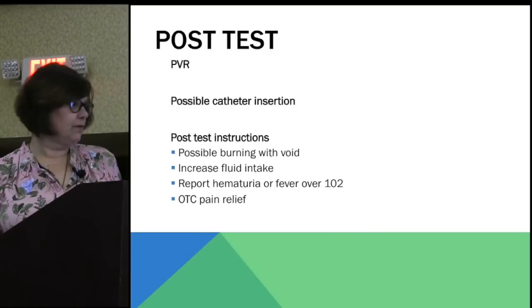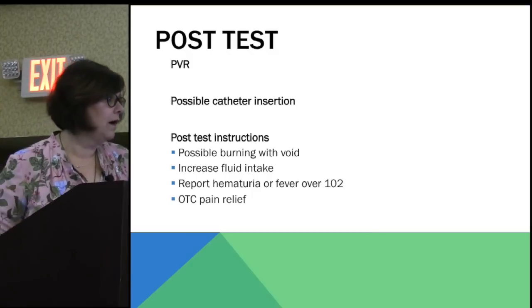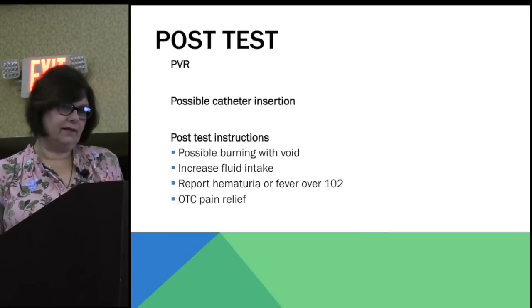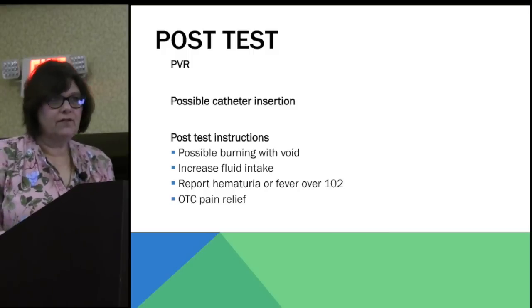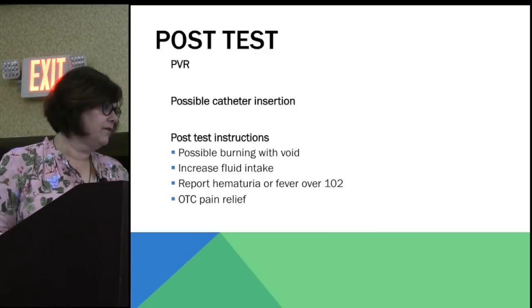Full bladders that don't empty are a great way to get urinary tract infections, repeated urinary tract infections. And then of course, for the next day or so, they might have some burning with void. That's because we put those catheters in, it's not comfortable, you may have had to reinsert them. Just let them know that's normal, push your fluids. And then again, do they have blood in the urine? Do they have a fever over 101, 102?